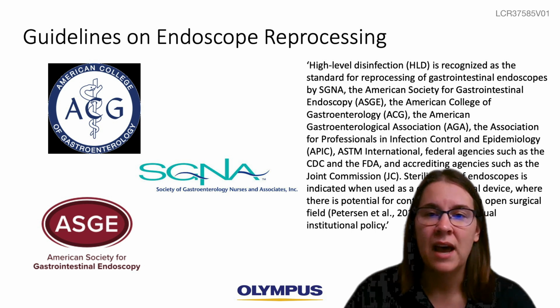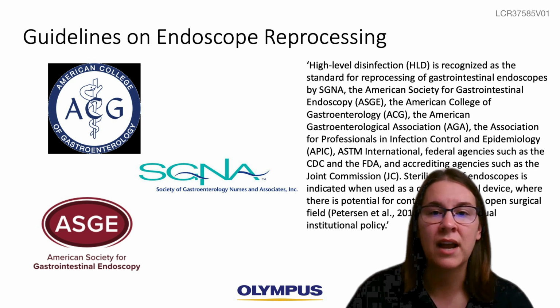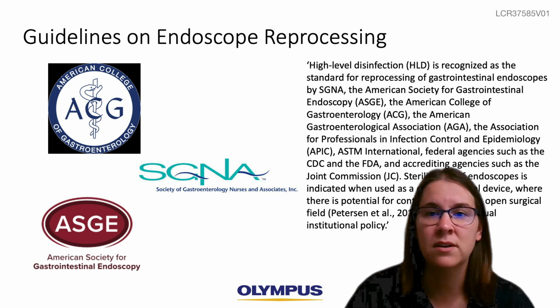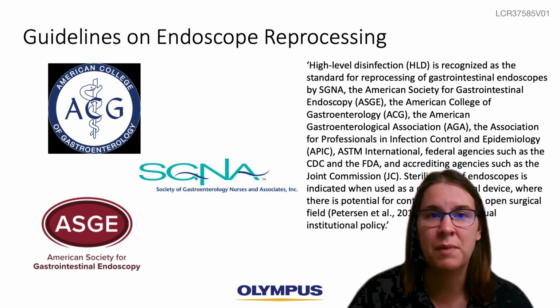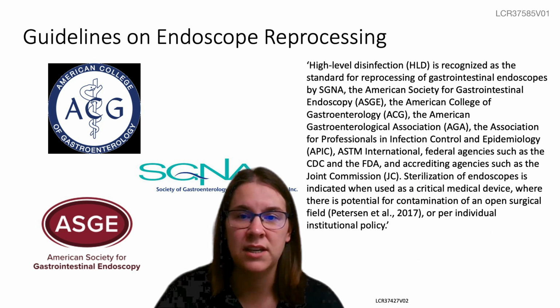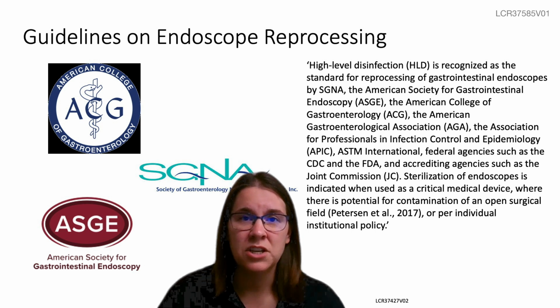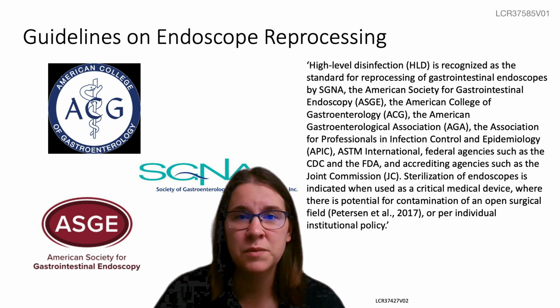I'd like to point out that high-level disinfection is still recognized as an acceptable standard for reprocessing semi-critical gastrointestinal endoscopes by many professional societies. These societies include the SGNA, ASGE, ACG, AGA, and more. Some guidelines may begin to recommend moving to sterilization for semi-critical endoscopes, but this is not a requirement. It is only a recommendation.